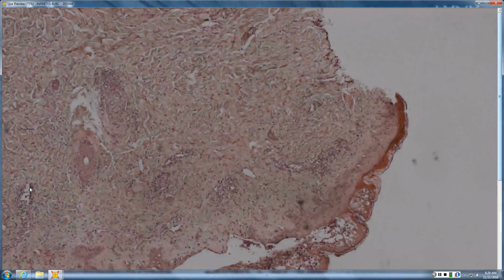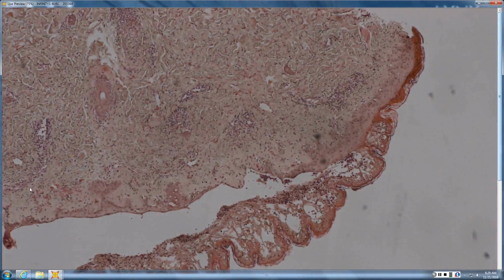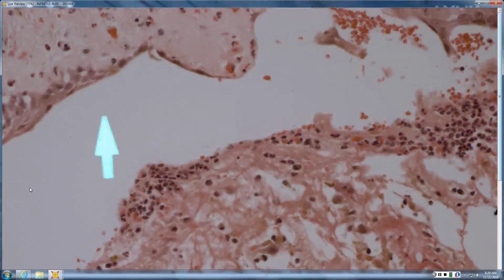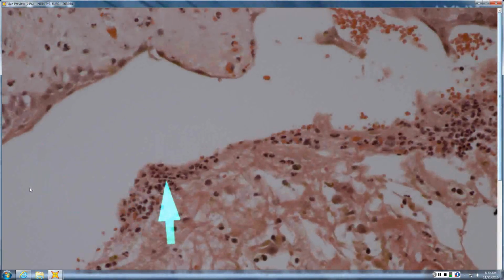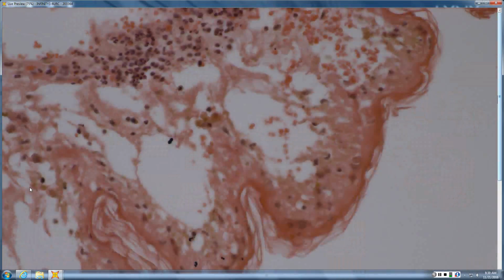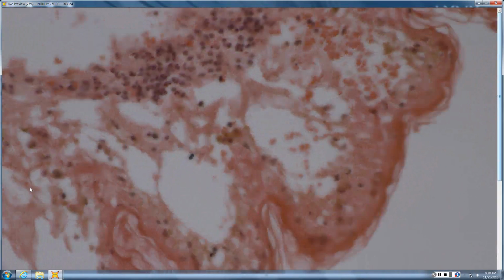And last one. Lots of necrosis and split. I mean, like SJS, TEN maybe? So like Stevens-Johnson, TEN. So there are lots of neutrophils, which could be just because it got secondarily infected, or could be primary to the process. Like linear IgA? The horn is certainly an acute horn, right?